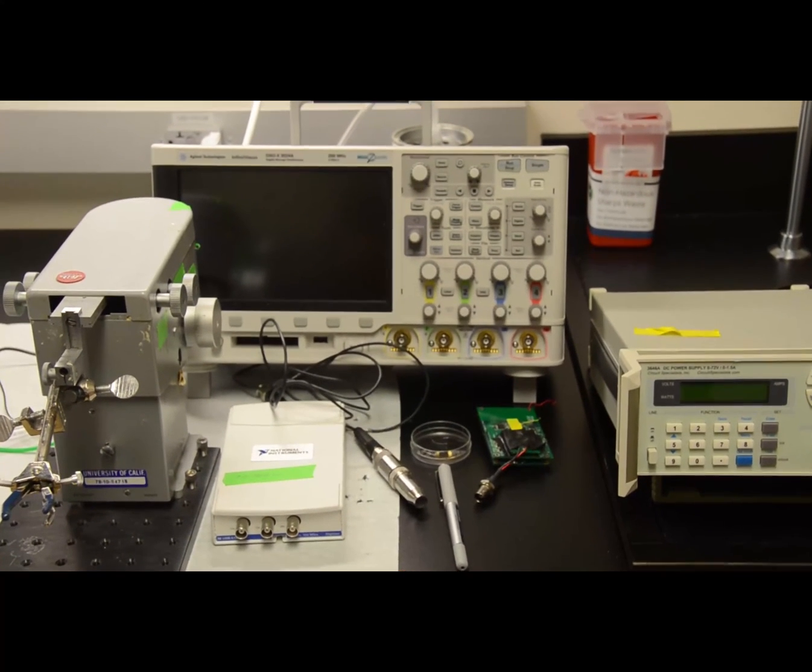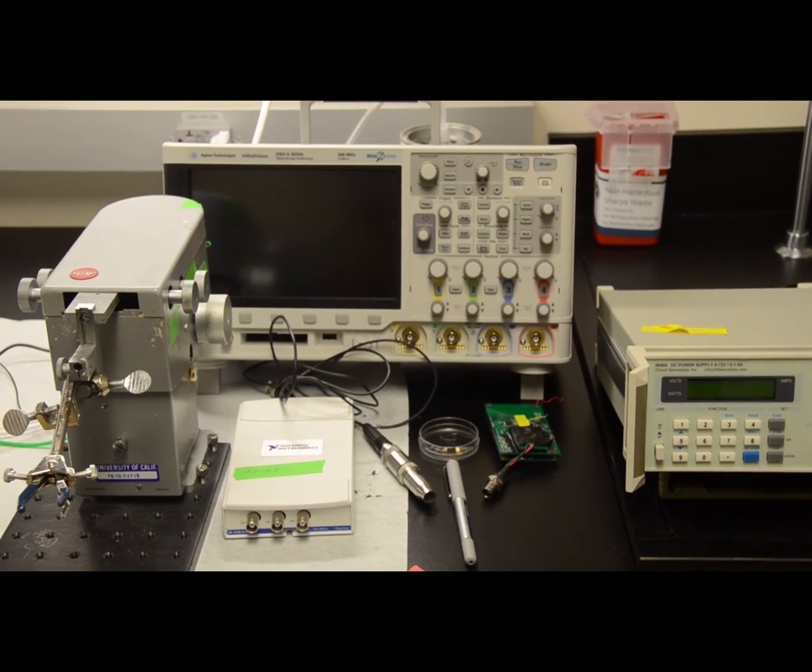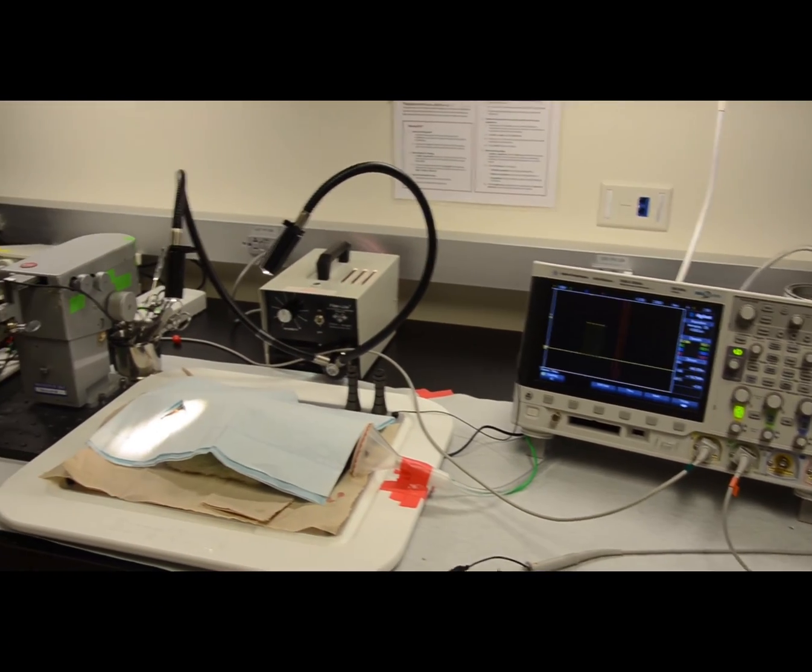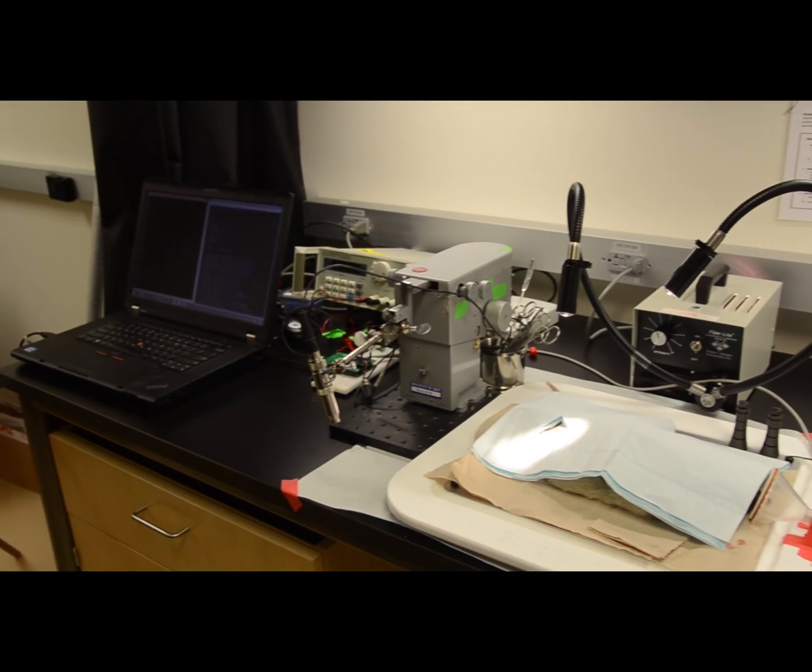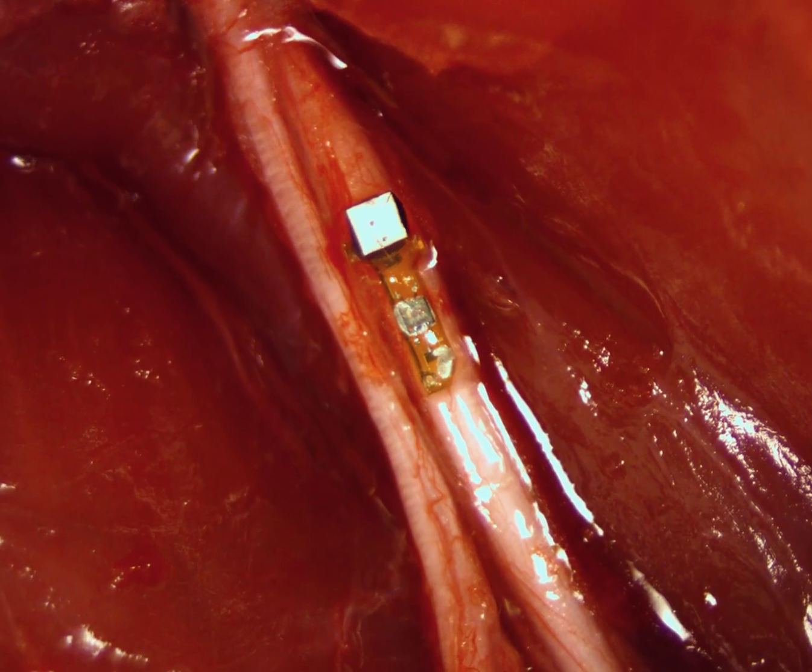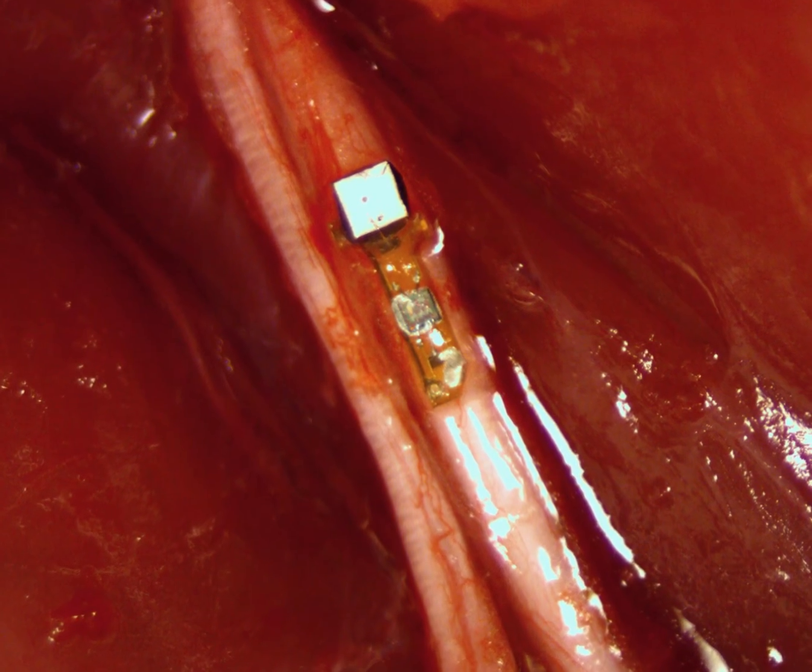The entire in vivo measurement can be done on a tabletop. Adult male Long Evans rats are used in all experiments and are anesthetized. The neural dust mote is placed either on the muscle for EMG recording or placed in contact and sutured to the epineurium of the main branch of the sciatic nerve.